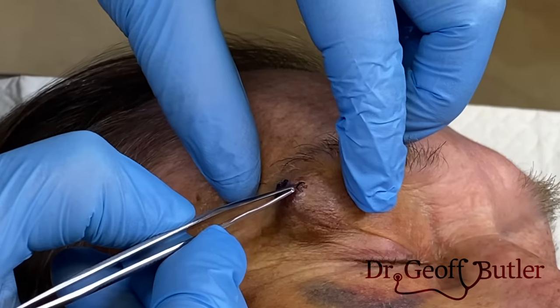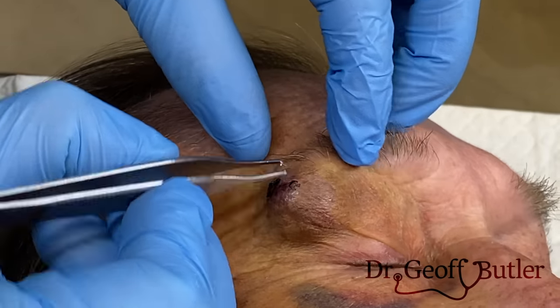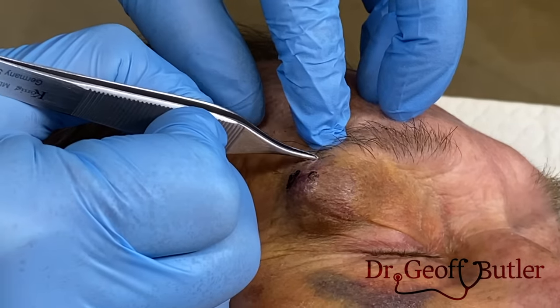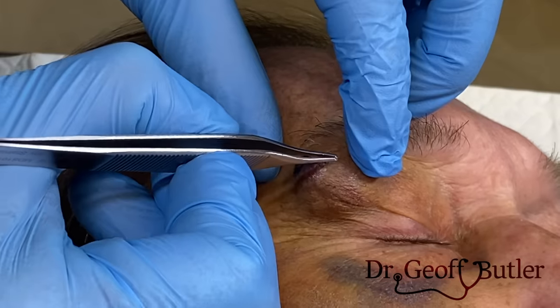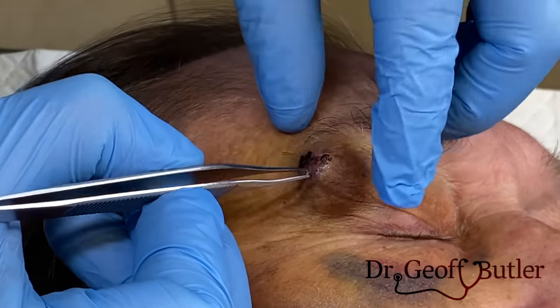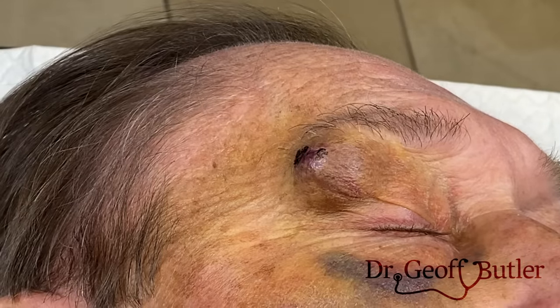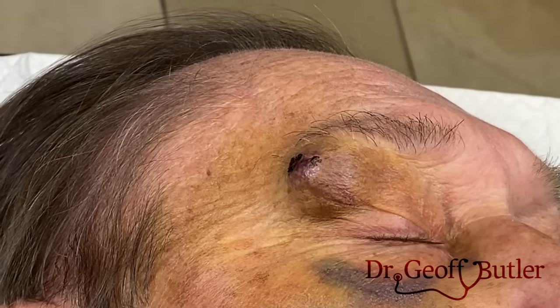We'll irrigate this and then stitch it closed. Now there was an abrasion and probably a breakage of the skin here — I would normally try to incise it around his eyebrow just to hide it a bit better. But I think if we can just do a small incision here, because this is probably going to have some scarring anyway. So I'm going to add some freezing here. We've already added some topical antiseptic.